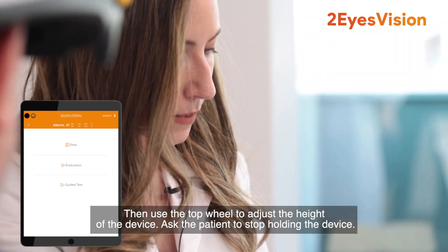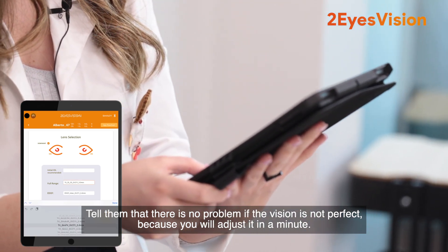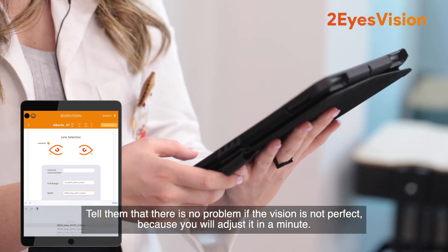Ask the patient to stop holding the device. Tell them that there is no problem if the vision is not perfect because you will adjust it in a minute.